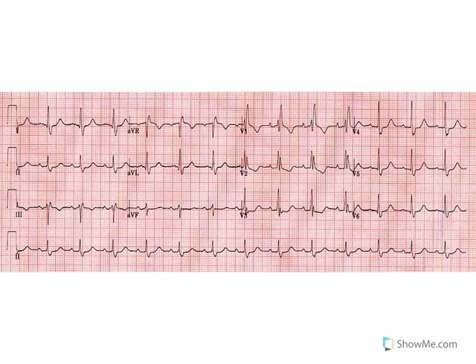Most S waves, when you see a QRS, you expect the S wave to come right back up. There's almost no time between the end of the R wave and the S wave. And obviously here you can see that there is, okay? And you can, again, look at all your lateral leads if you want to. You will see this sort of lazy S-wave pattern. You can even see it in this one in V5. And there you go. There's your S wave going back up.